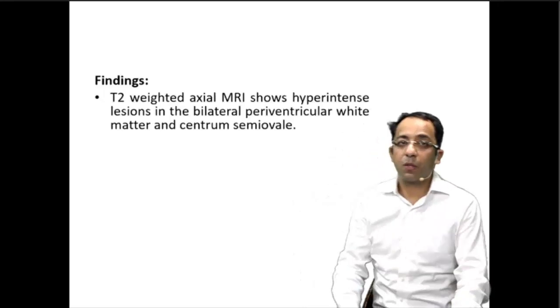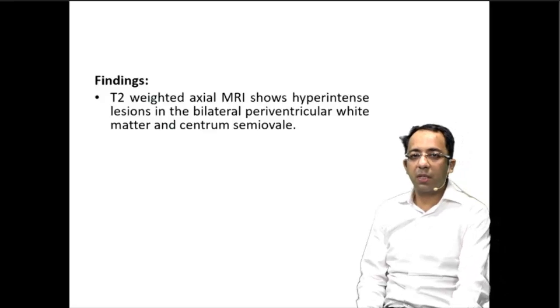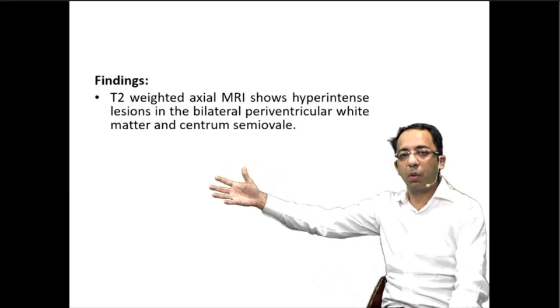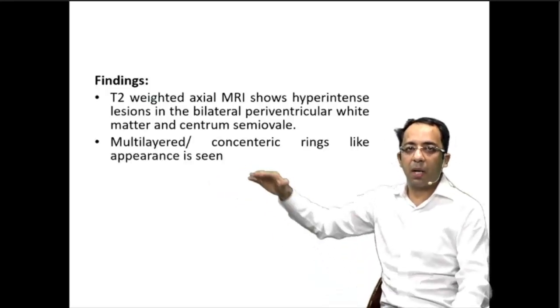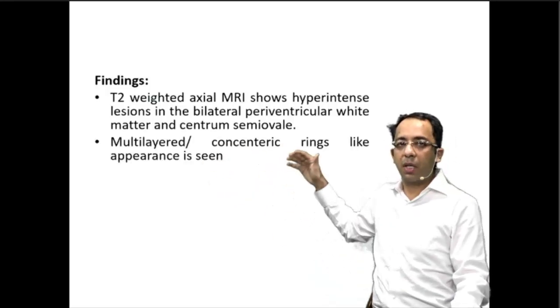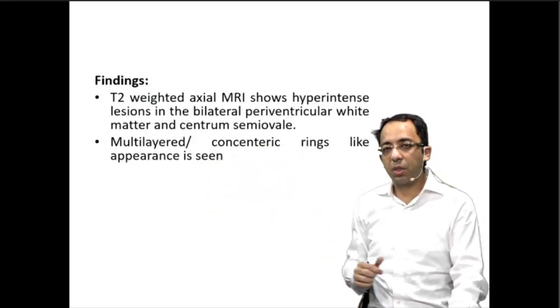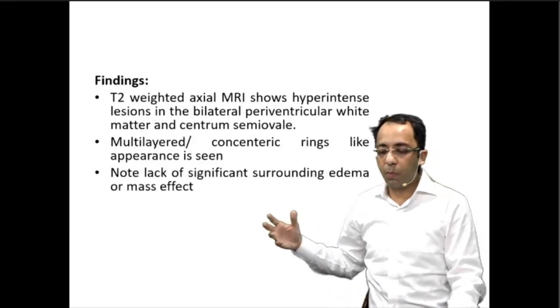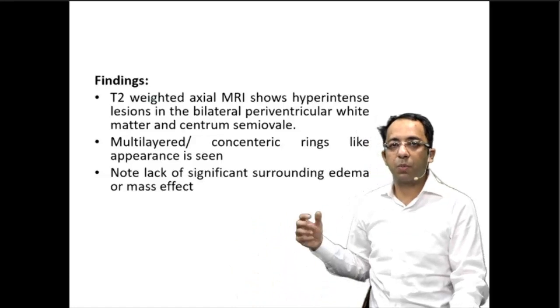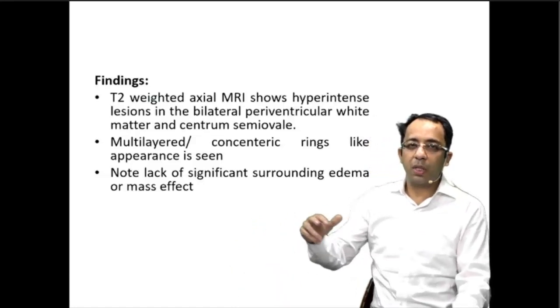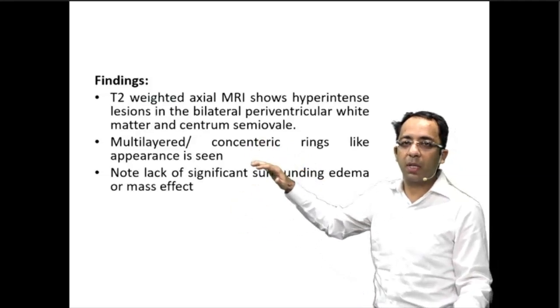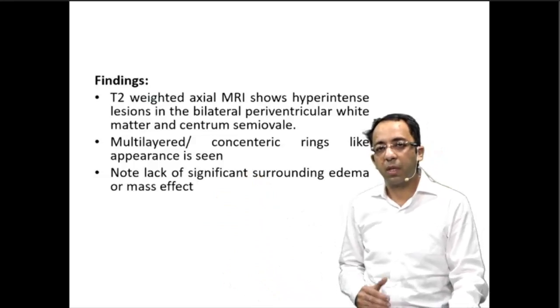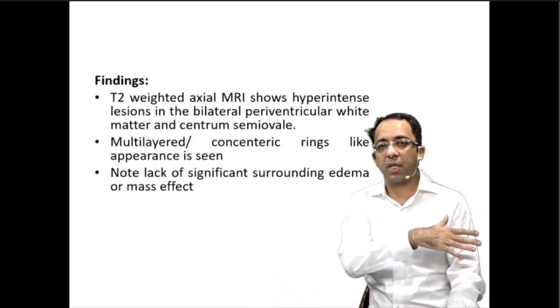Let's summarize. What we saw in this patient was hyperintense lesions in both the periventricular white matter and in the centrum semiovale area. These hyperintense areas had a multi-layered, concentric, onion-peel-like appearance. There is not much mass effect and not too much edema because of the lesion — all pointing towards a demyelinating illness.